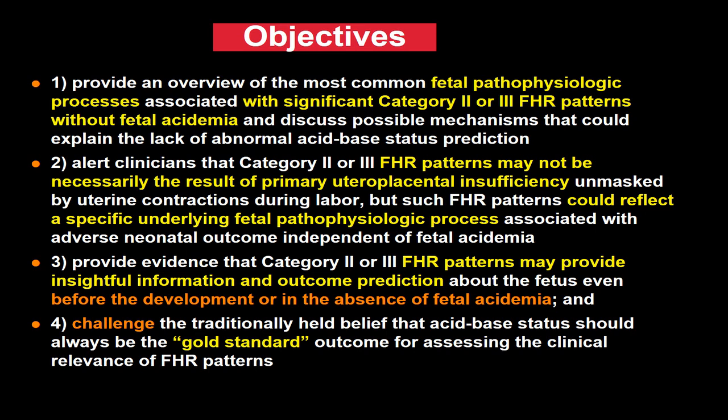Number 3, provide evidence that Category 2 or even 3 fetal heart rate patterns may provide insightful information and outcome prediction for the fetus even in the absence of fetal acidemia. And number 4, challenge the traditionally held belief that acid-base status should always be the gold standard outcome for assessing the clinical relevance of fetal heart rate patterns.